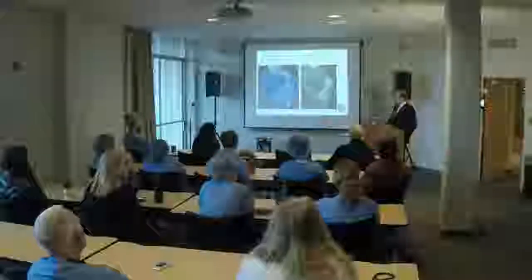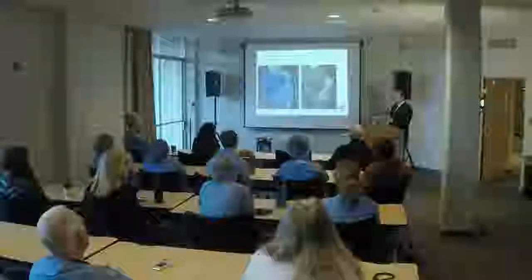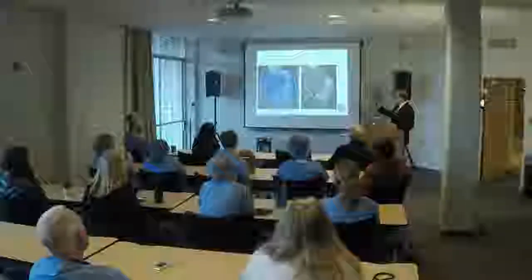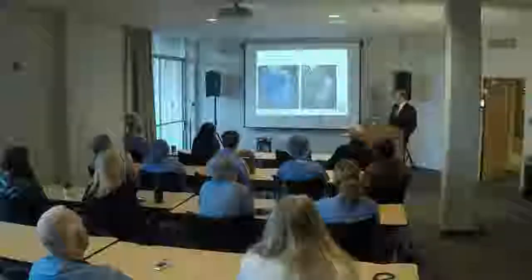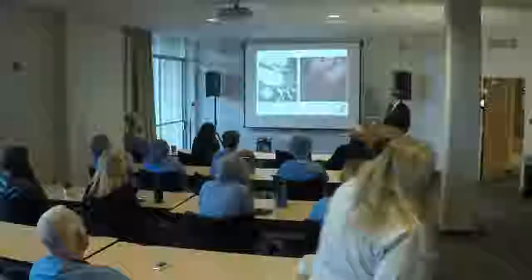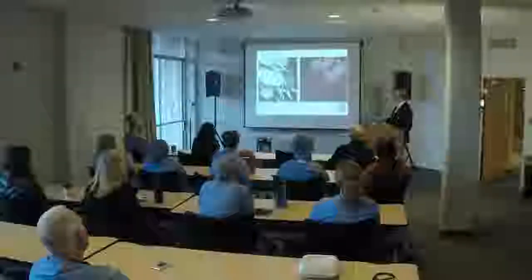Because they're three-dimensional acquisitions, you can rotate the images in multiple planes and orthogonal cuts. You can splay out the epicardial coronary arteries, such as this. This is an example of the right coronary artery, demonstrating no evidence of obstructive coronary artery disease. Here are a couple examples. Anyone want to take this case? What are we seeing here?